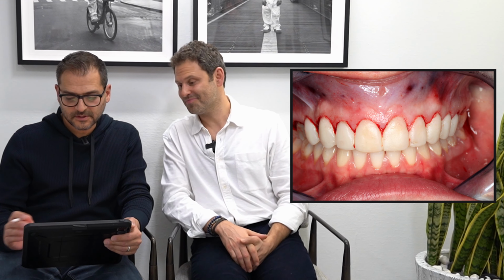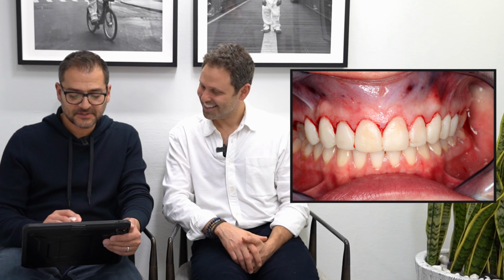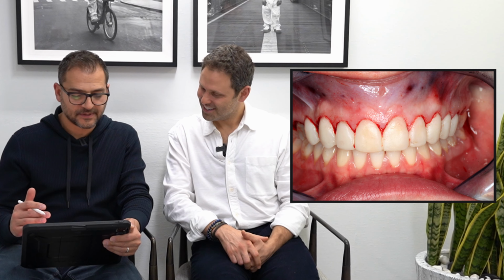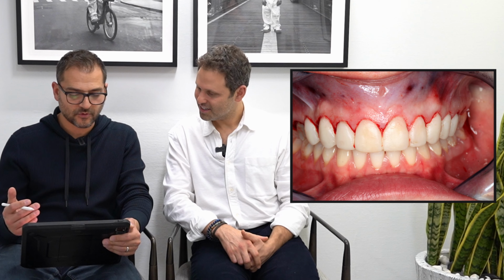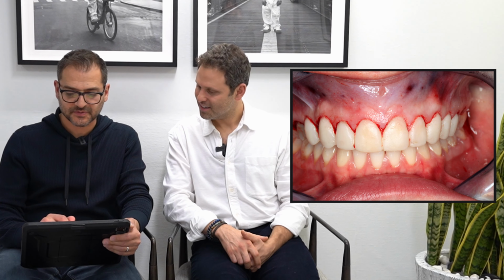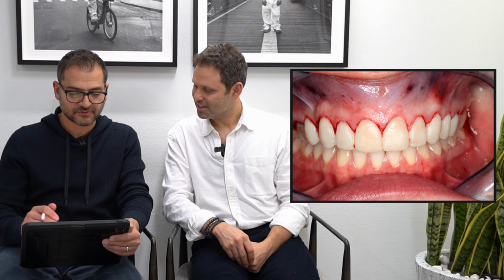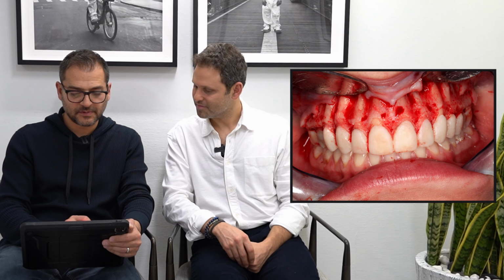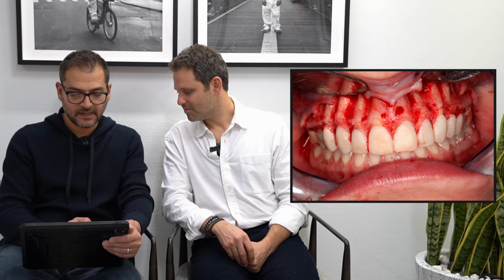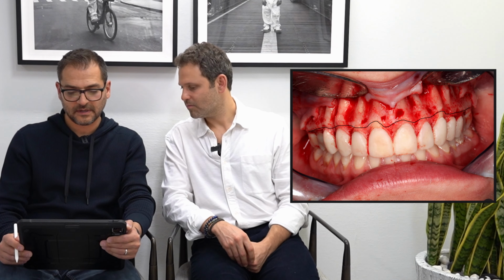And this is awesome. I was very fortunate to receive a patient who was already numb, so thank you for that. At this point, you can see that the laser treatment addresses a little bit the length of the teeth. There's a little bit more length and a little bit more white showing in the smile, but it's not enough, especially if we're trying to address the original cant we were talking about earlier. So in this picture, you can really see that her bone level has a very flat, uneven, and imbalanced level.